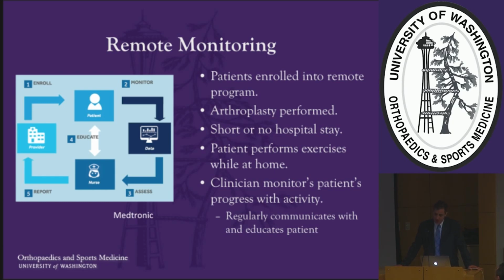There's a clinician at a remote site who is able to monitor data taken from the patient during their rehabilitation, and using that data can assess how they're doing, provide education, as well as intervene if necessary. This also allows the surgeon to have almost real-time information about how the patient is doing at home with their activities on a day-to-day basis. So how do we achieve the remote monitoring?